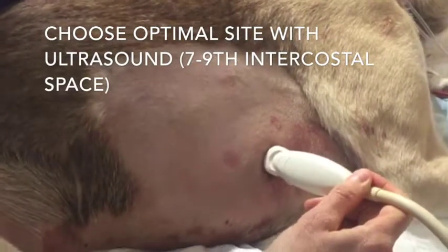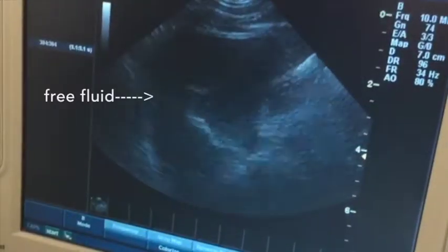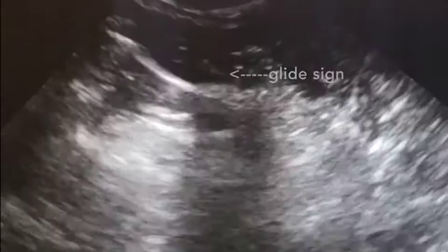Select the optimal insertion site using ultrasound. You may see free fluid, or in the case of pneumothorax, loss of the glide sign.